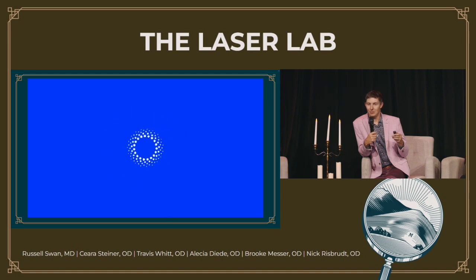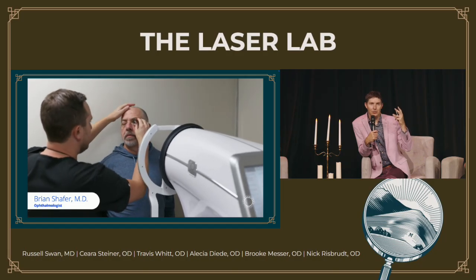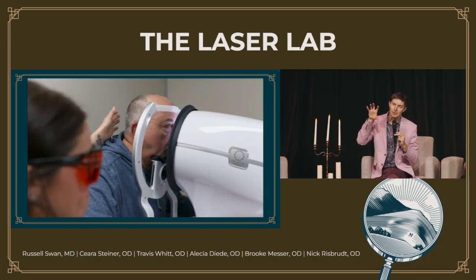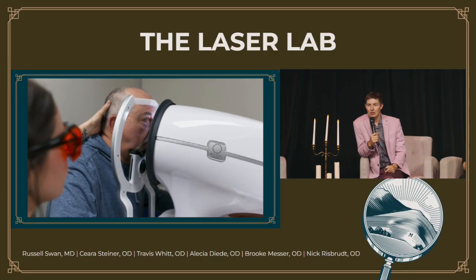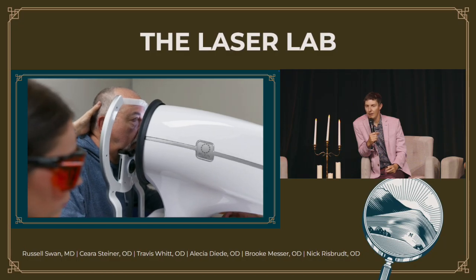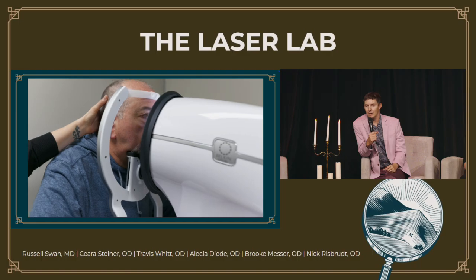Ooh, that even comes with fun music. Little pressure on it. So you put a little eye speculum in, similar to if a patient was to have an injection. They move forward. This auto-detects the patient's limbus and then delivers the energy. And the energy delivery is just a couple seconds, as opposed to a minute, 2 minutes of monkeying around with the lens that's on their eye. So they're stabilized. You'll hear Brian talk about once he gets it registered. It's going perfectly. Don't you worry about a thing.